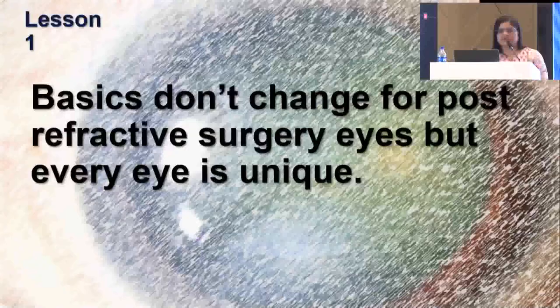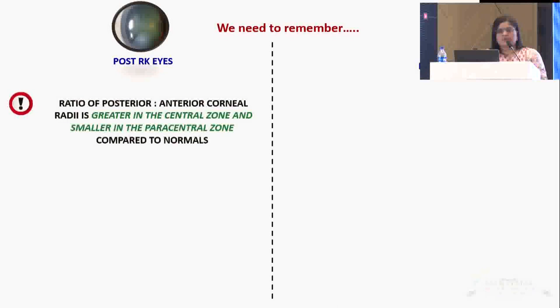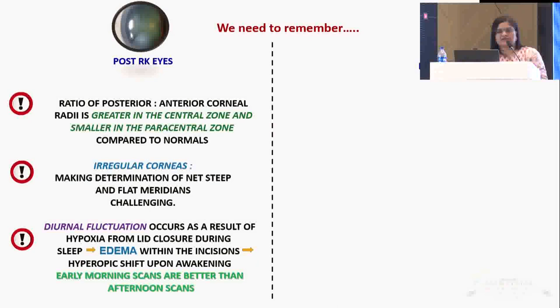So lesson number one is that the basics don't change for post-refractive surgery eyes, but every eye is unique. Once we keep that in mind, we have to remember that in post-RK eyes, like Dr. Rohita mentioned, the ratio of the posterior to anterior corneal radii is greater in the central zone and smaller in the paracentral zone. You have an irregular cornea to start with, and there is going to be diurnal fluctuation, which occurs as a result of hypoxia from lid closure, leading to edema, leading to hyperopic shift when the patient wakes up. So eventually the early morning scans are going to be better.